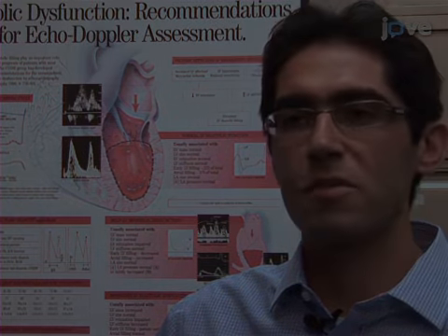In cardiac physiology, relaxation and stiffness are two well-established physiological parameters that characterize diastole. The PDF method can help answer key questions in the field of cardiac physiology because it uncouples the key drivers of diastole into non-invasively measurable parameters.